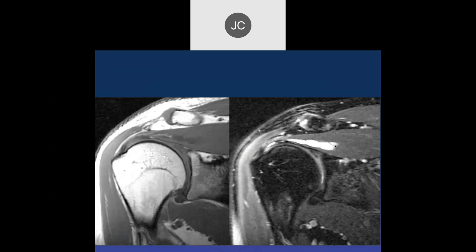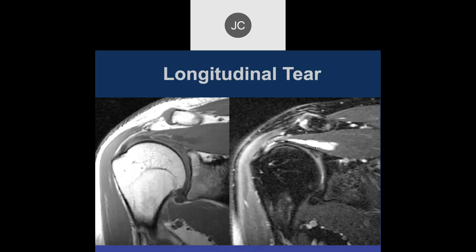Looking at two coronals of the supraspinatus: there's increased articular-side signal on PD fat-sat, and then some cystic fluid tracking posteriorly or medially. I like to call these longitudinal tears — interstitial tears which communicate with the joint-side surface. They tend to fill with fluid like this and can actually become very large, similar to large intramuscular cysts. These should be treated as partial tears.